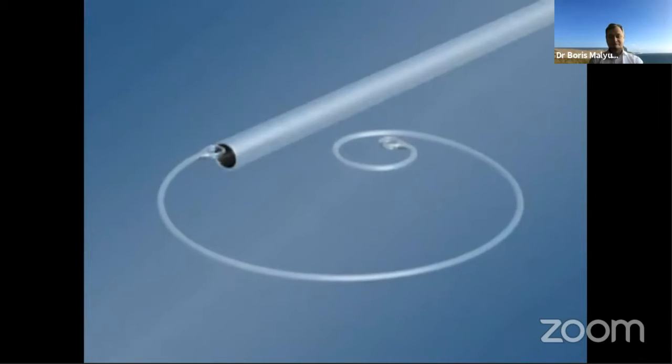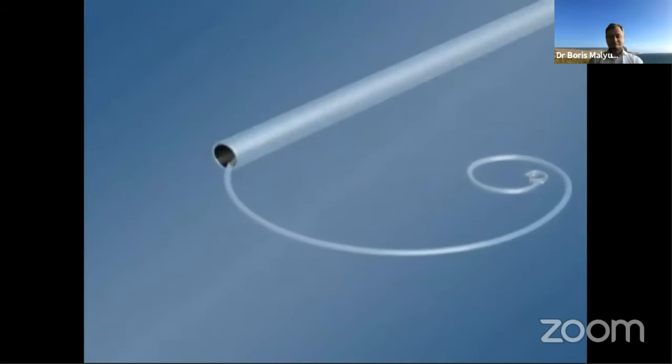The Malugin modified CTR has an eyelet that is moved to the very tip of the device. That makes it much easier to implant into the eye with the help of the injector.